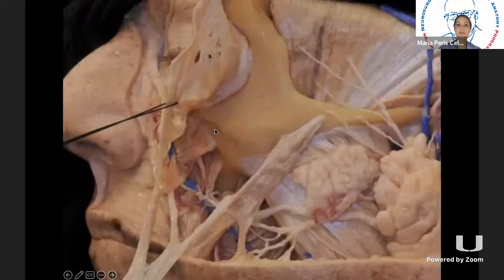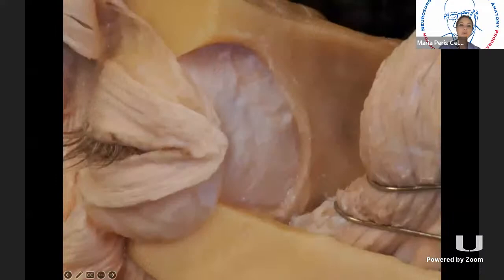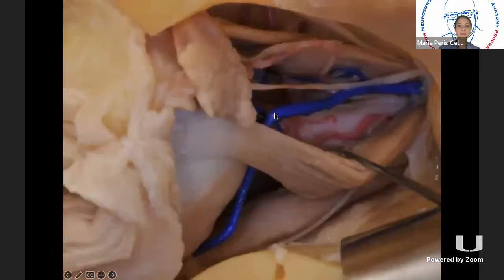And if we dissect it further from lateral to medial, we're going to find the orbital ring, the external aspect that continues with the zygomatic arch. And the relationship between the orbit, the temporalis fossa, and the temporal dura is very important, as we are going to see. So if we remove the orbital rim and then we drill part of the sphenoid wing, we're going to find the periorbita.